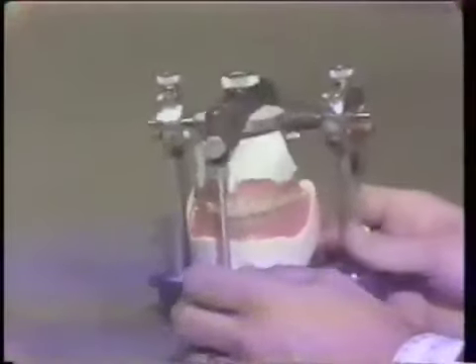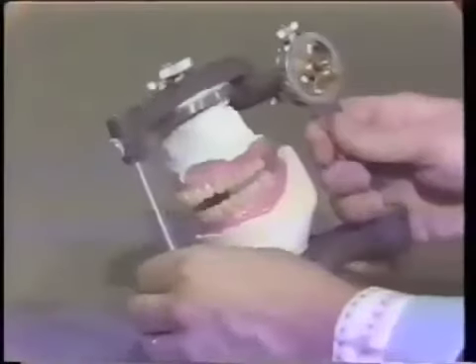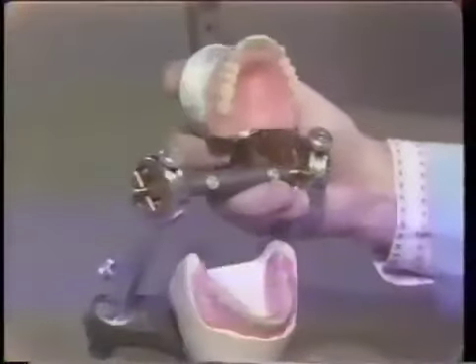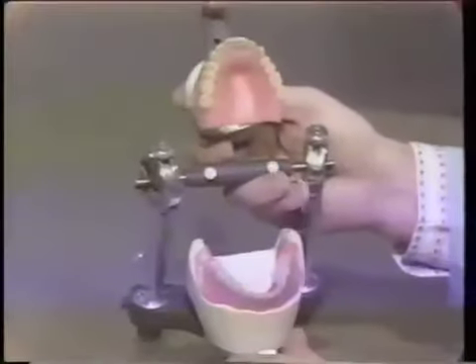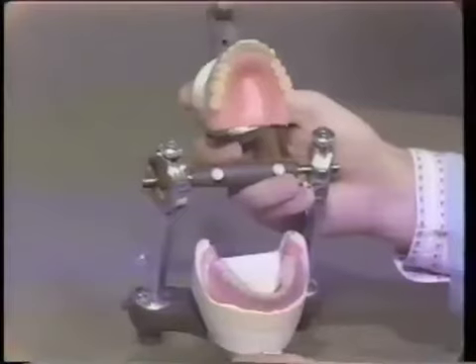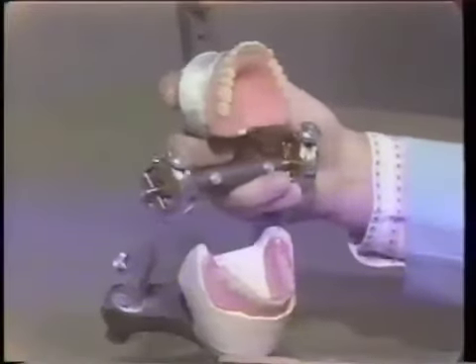It is important that we remove all the wax. The wax has been removed from the teeth, so it does open the sticky wax. But it's important that we make sure there is no residual wax on the tooth surfaces themselves and that the teeth are dry, because the articulating paper ink will not adhere to the teeth if they are wet.